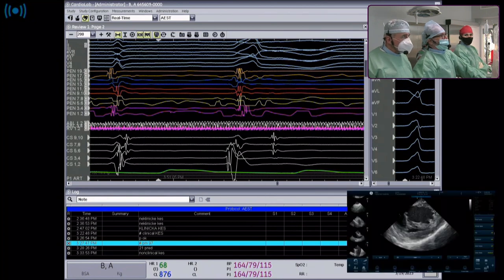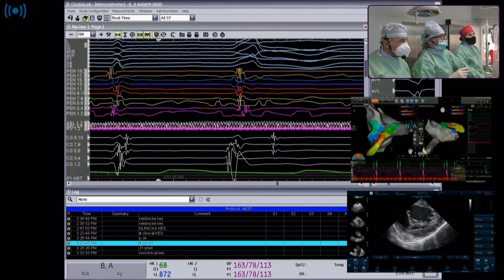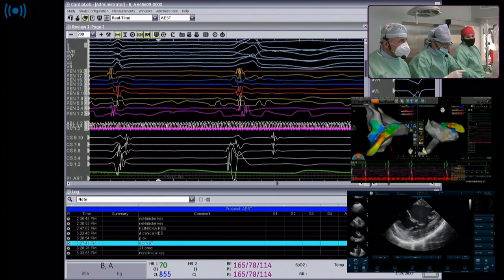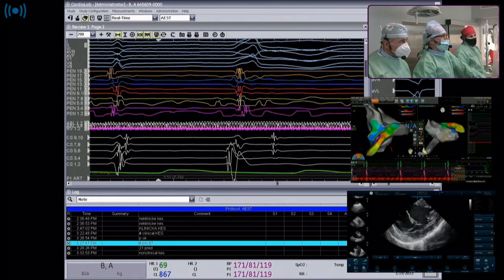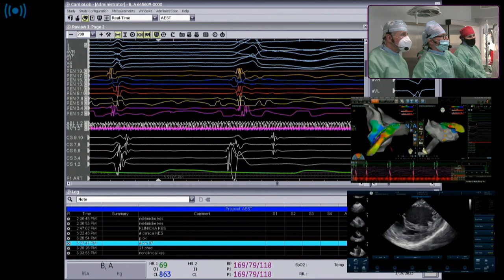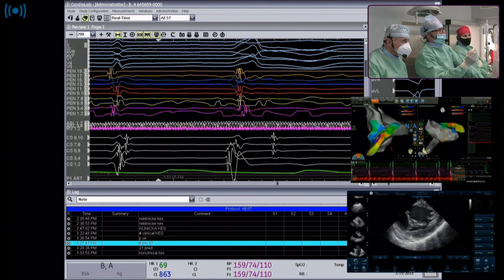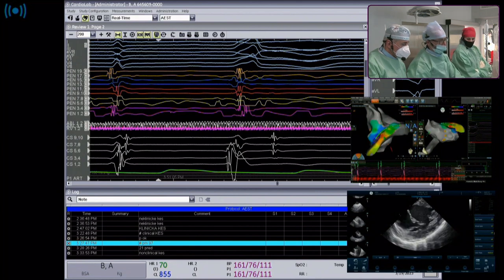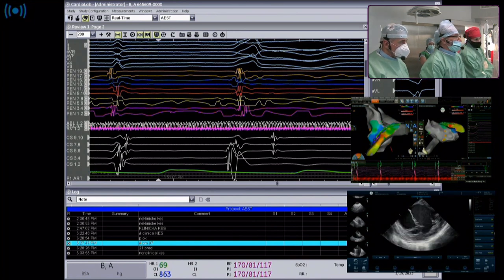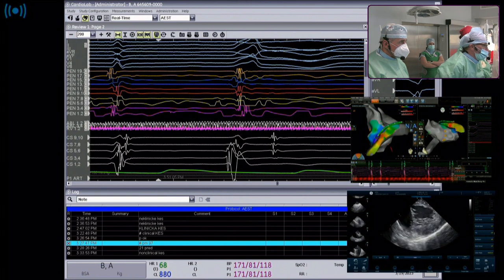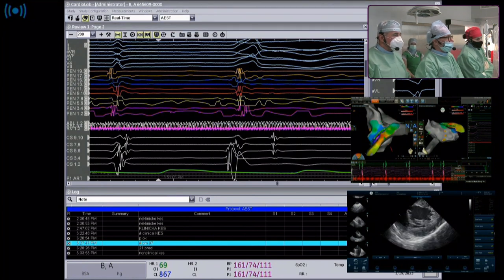We tried to get the EP star into that vein but the vein is super small. With a lot of work I got the tip of the EP star outside the AIV and close to that branch. We only have signals from the very distal electrode. We can pace from the distal EP star - the pacemap doesn't look as good as from the vein. V2 is different, worse. From the AIV we're getting 96-98%, from here 94-95% - within the error of measurement.